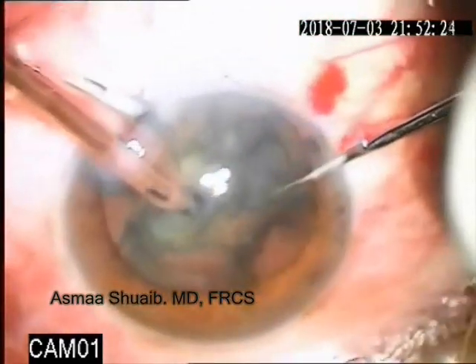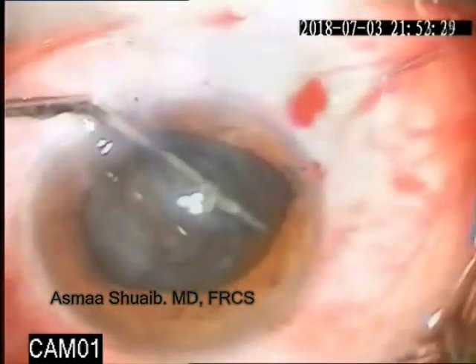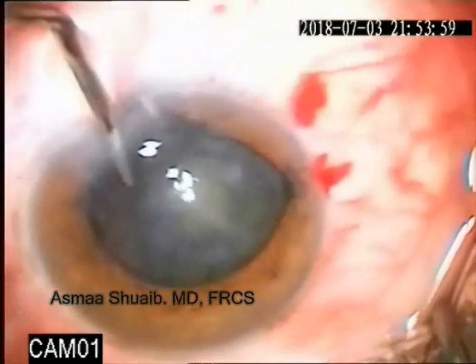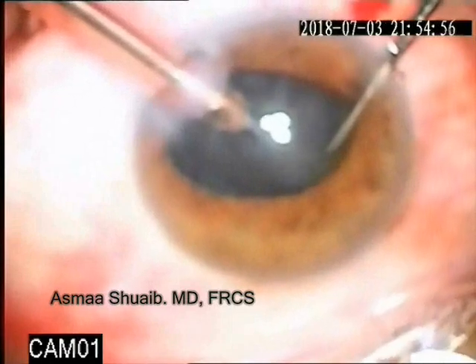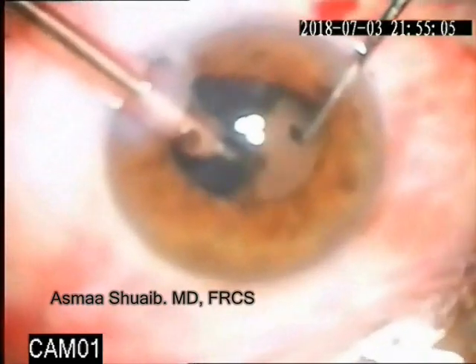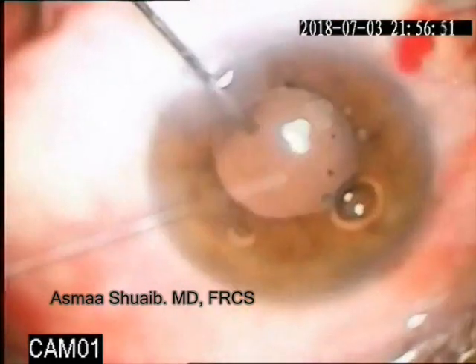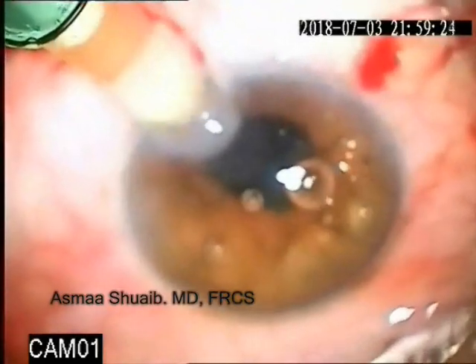This soft lens matter was removed in a piecemeal pattern. While visco-dissection was done, IA was done for the remaining cortex, and the IOL was implanted in the bag.